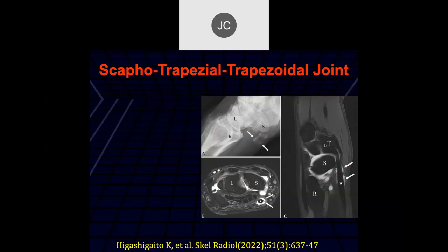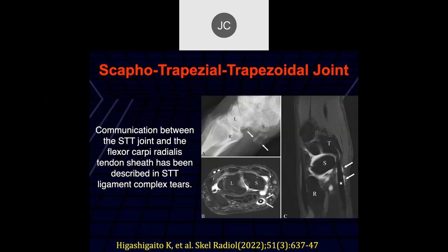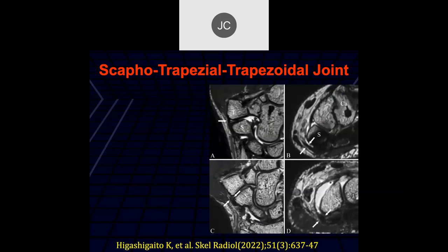Taysen: there's a star and arrows over the flexor carpi radialis — there's tenosynovitis there. Looks like they injected some contrast here, and there's the joint space — I think this was an arthrogram injection. I've actually never done an injection of this joint myself. You can see a lot of the different ligaments in this area — usually what we're interested in is either traumatic injuries and fractures or the degree of degenerative disease.